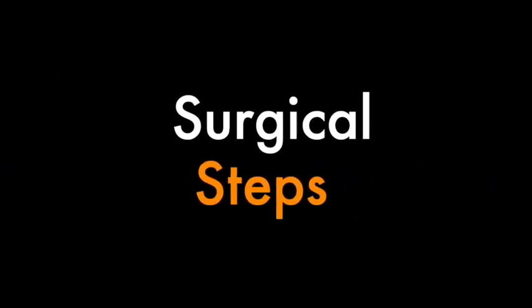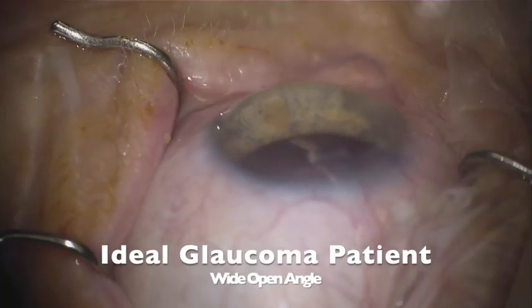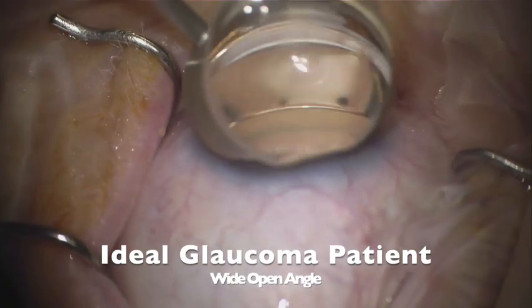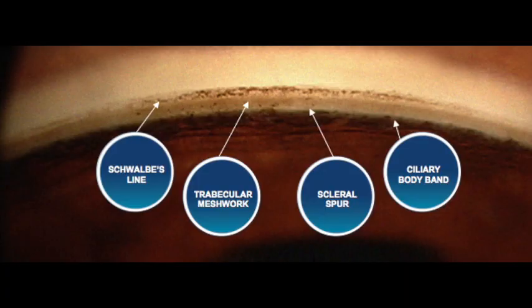So let's now check out the actual surgical steps. First, the ideal glaucoma patient is going to be one with a wide open angle and normal anatomy. Just to review, with angle surgery, our aim is for the trabecular meshwork above scleral spur to enter and gain access to Schlem's Canal behind.